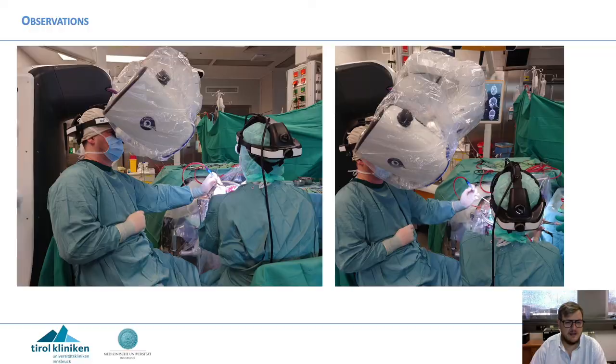But we also had some observations that caught our eye. You see in the same surgery that the assistant can be influenced by the robotic scope — it is quite close to his head while looking downwards at this very medial angle.